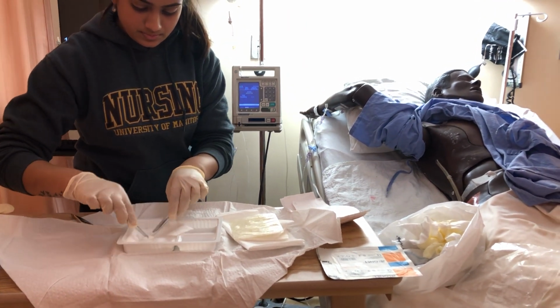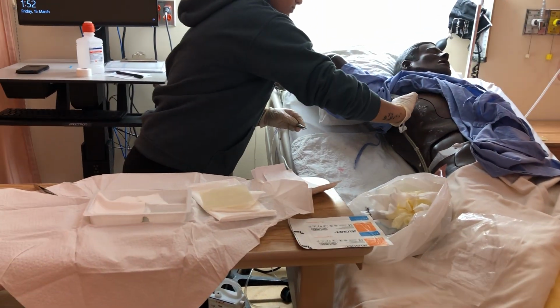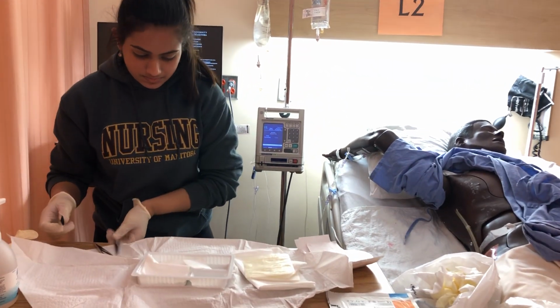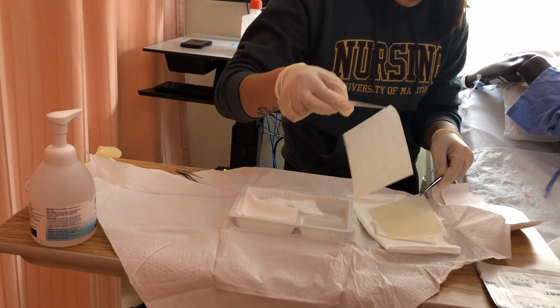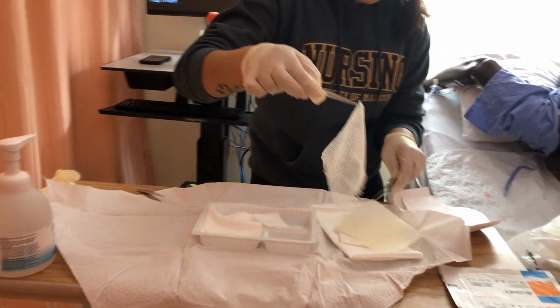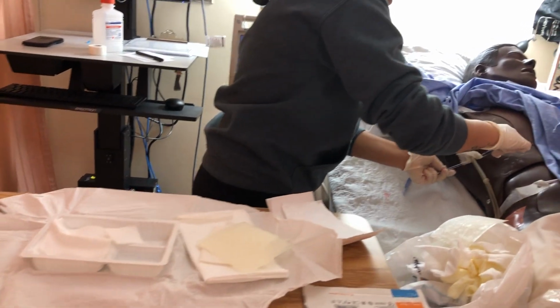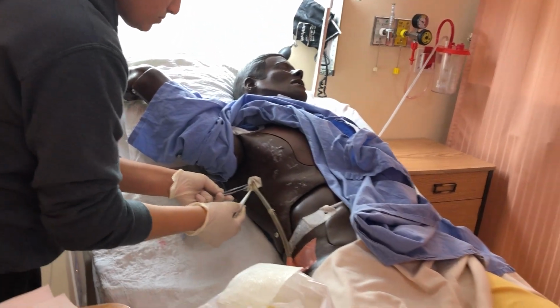So now I'm just going to clean out my supplies, make sure my patient's comfortable. I'm making sure that I've documented that I gave the insulin. Now that I've cleaned and dried it, I'm going to apply my jello net around. I would document the dressing as well, that it was done, the amount of drainage, the suction as well, what the site looked like. Okay, I'm just going to place this around. I think that's it. So exit safety check.